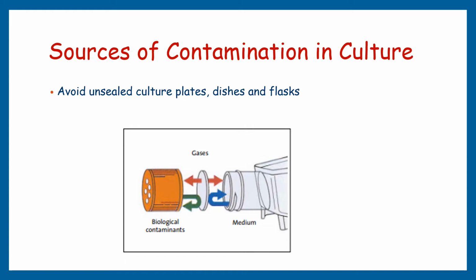the culture vessels. Even without any detectable film, fungi as well as other microorganisms can grow on the outside of culture vessels. Eventually, their hyphae grow right up the side wall of the dish or past the cap into the neck of the flask. This is more often observed in long-term cultures maintained in the same unsealed culture vessel. Small insects and other invertebrates can also make temporary visits into unsealed cultures, especially dishes and plates, leaving behind only the contaminants carried on their feet.